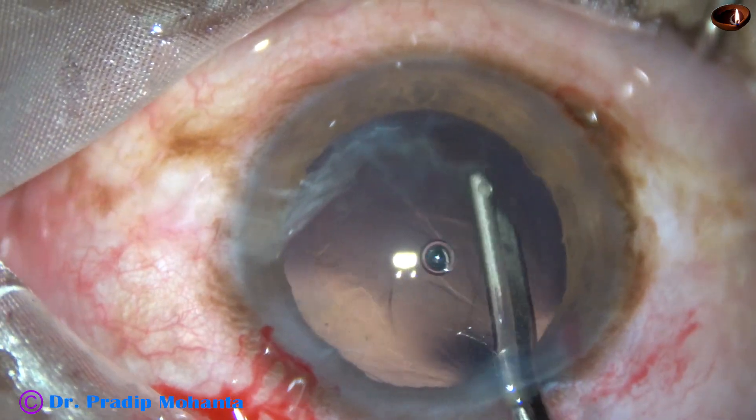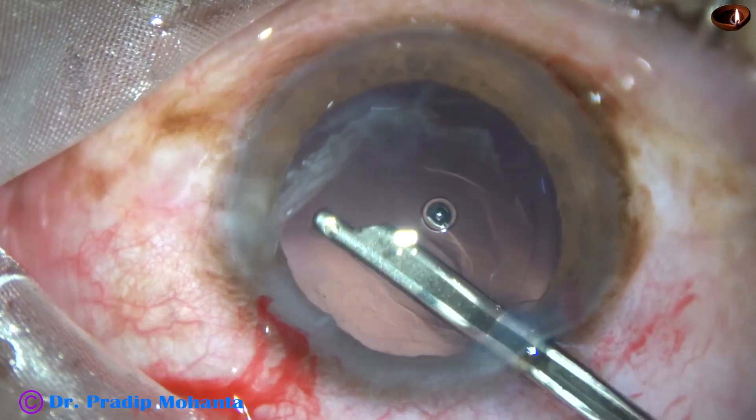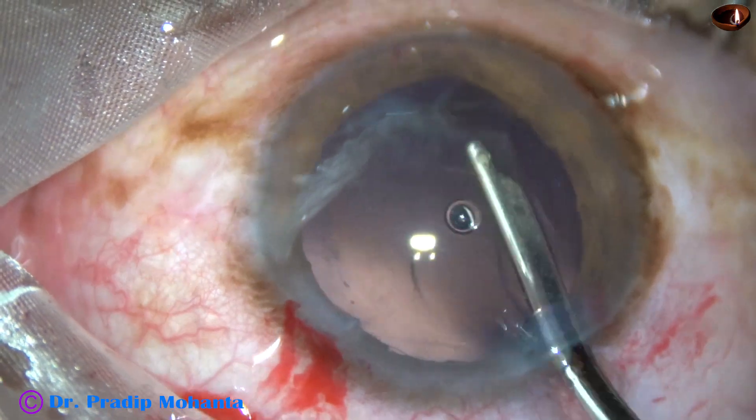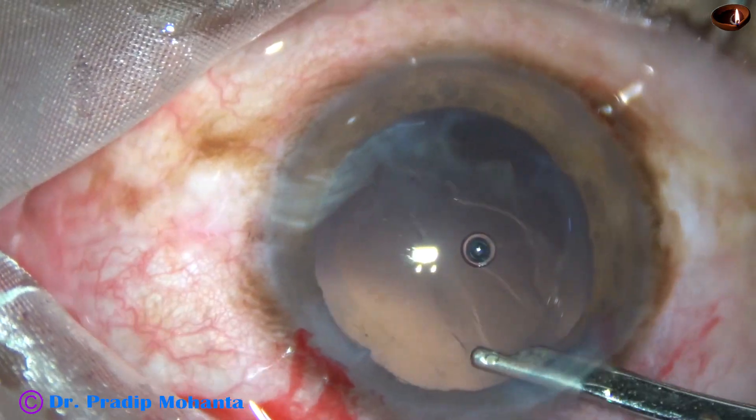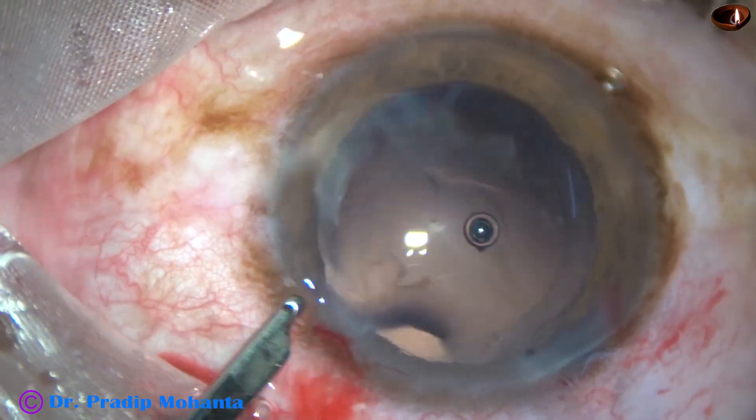Cortical clean-up is now done. There was very little cortex in this case. It has been done with the help of a 23-gauge Simcoe cannula.